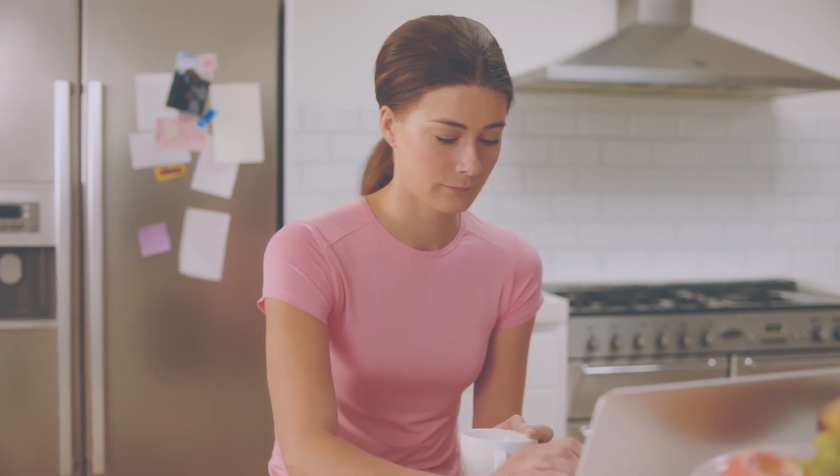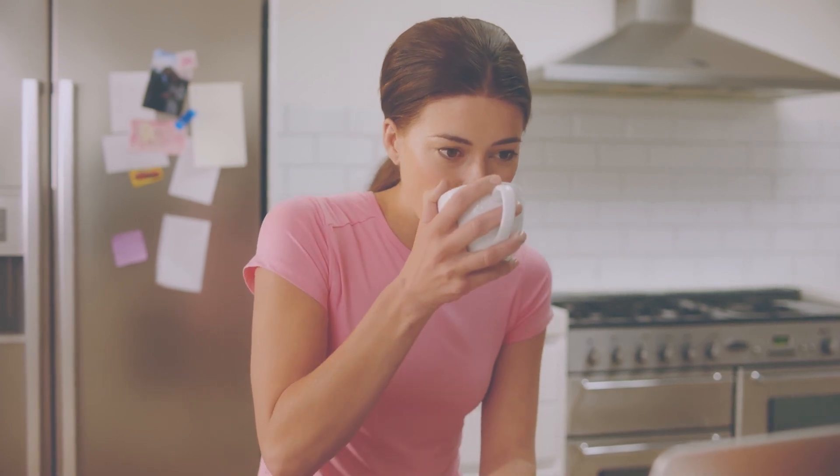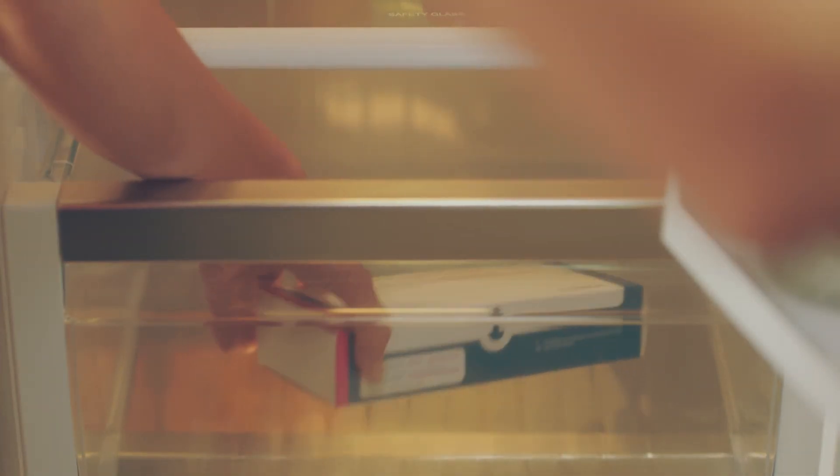Hi, I'm Rachel. My husband Tom and I decided to start fertility treatment after we'd been trying for a baby for a while. As part of my treatment, I've just been prescribed Pergoveris. It can feel like there's a lot going on and so much for you to remember, but don't worry — we'll go through how to use your pre-filled pen together.